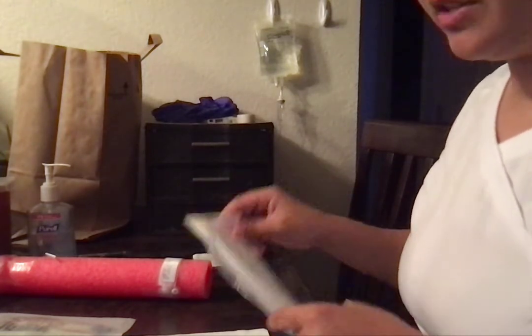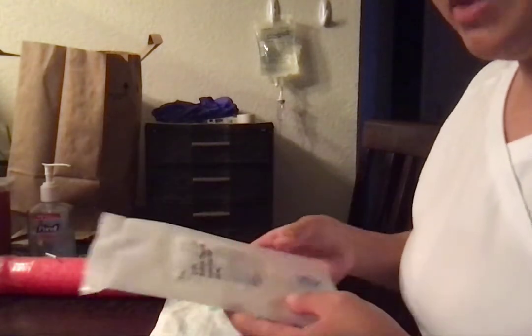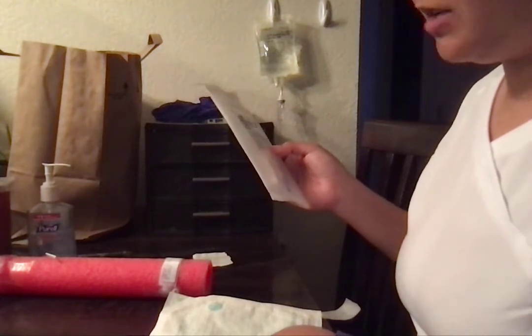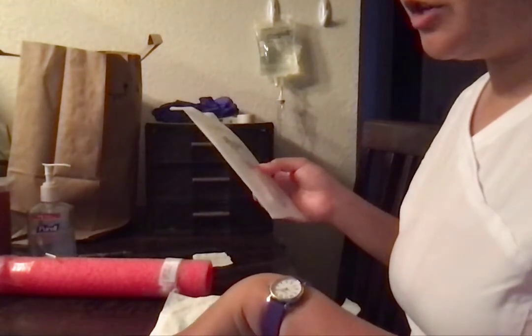Actually, before I get everything started or opened, I'm going to go ahead and do my third check just to make sure that I have the right medication against her MAR. So we have the right patient, Millie Larson, and we confirm the date of birth. Millie, do you have any allergies? No, you don't? Okay, I just wanted to make sure because that's what your MAR says.